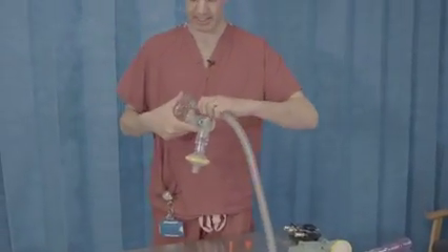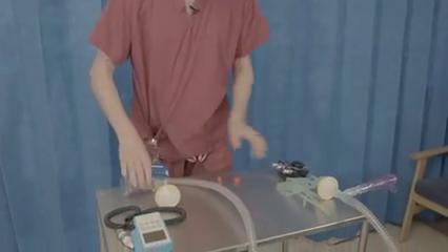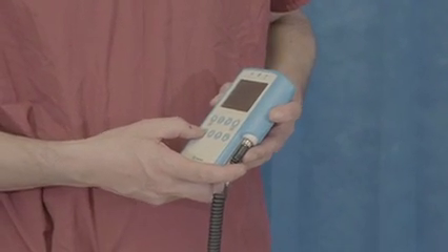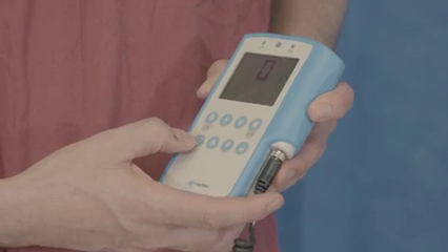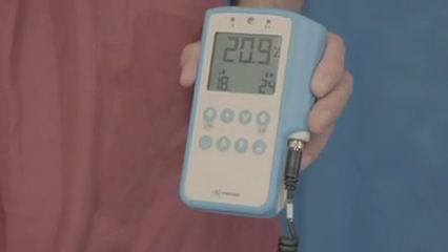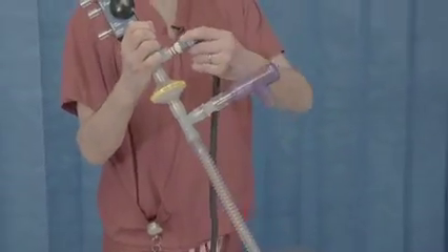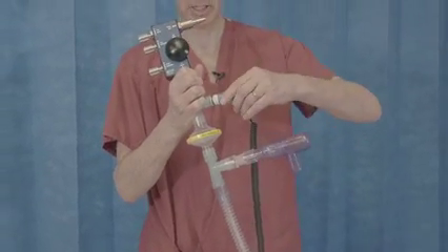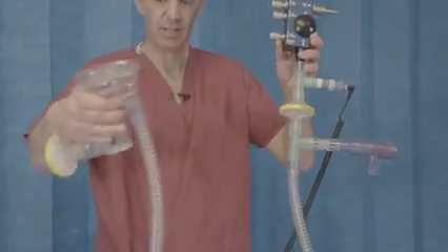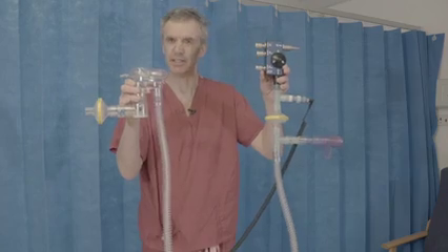Now we will just attach the mask to the circuit. We have our circuit complete — and attach the flow generator. The last thing we need to do in the preparation is to turn on and calibrate our oxygen analyzer, which is reading 20.9% — that's about right. We'll now add that to the circuit by putting it into the top T piece, and it should just fit snugly like that. So there we have the flow generator, the oxygen analyzer, and the disposable patient circuit complete.